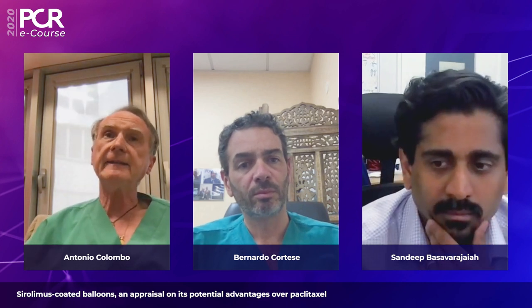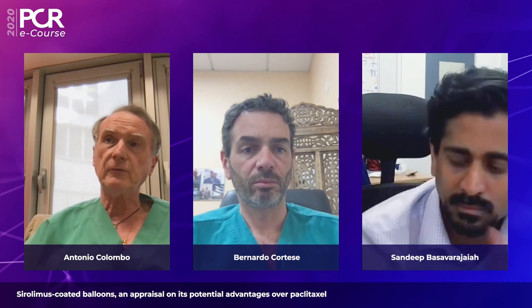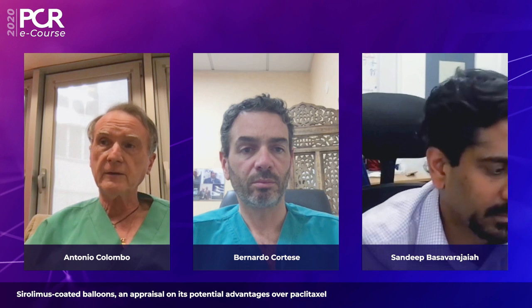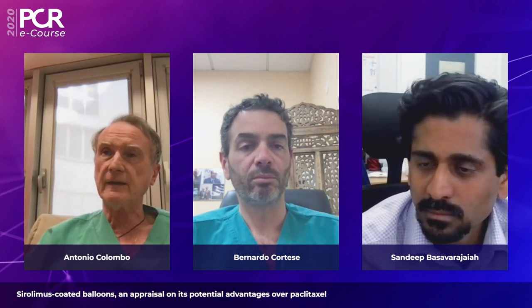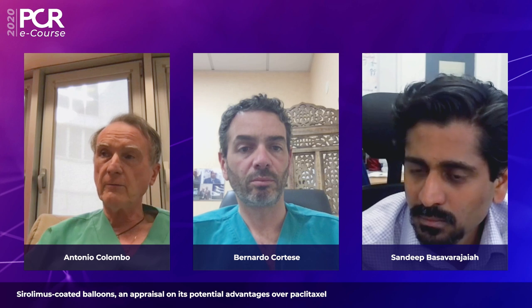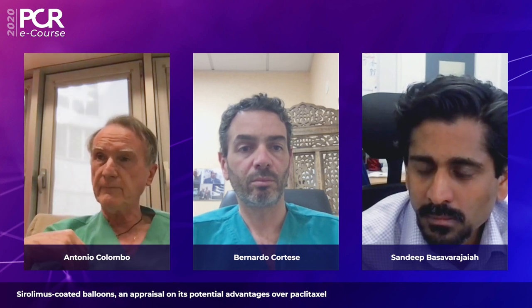Okay, so I think what can we take home from this symposium? I would say that in-stent restenosis is still a main area where you should utilize the drug-coated balloons, because you should try to avoid placing another layer of metal. Nevertheless, you cannot dismiss optimal lesion preparation, and I would say almost every case of in-stent restenosis should be evaluated with IVUS in order to determine if you have inadequate stent expansion. I think examples were shown in this symposium.